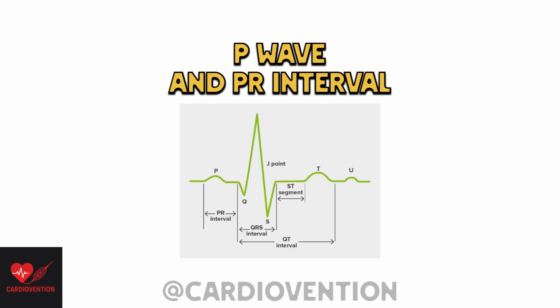These simple looking waves carry powerful insights about atrial and AV conduction. We will go into their physiological basis, normal measurements, and the clinical significance of their abnormalities.